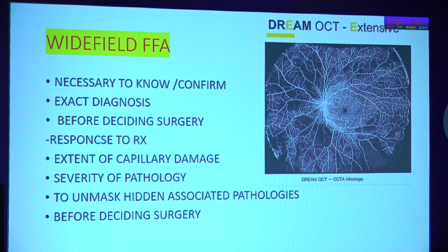So in conclusion, it is necessary to confirm the exact diagnosis before deciding surgery, before seeing the response to the treatment. In addition to the treatment, you need ultra wide angiographies. We don't usually repeat the angiographies, but here we know that it is a safe procedure. In my 25 years of practice, we have done dye angiography several times, but hardly one or two patients got a little bit of itching and anaphylaxis, and it was manageable. So there should not be a fear of dye angiography.